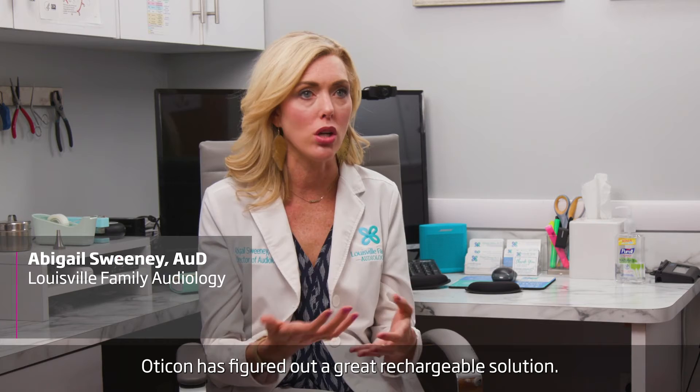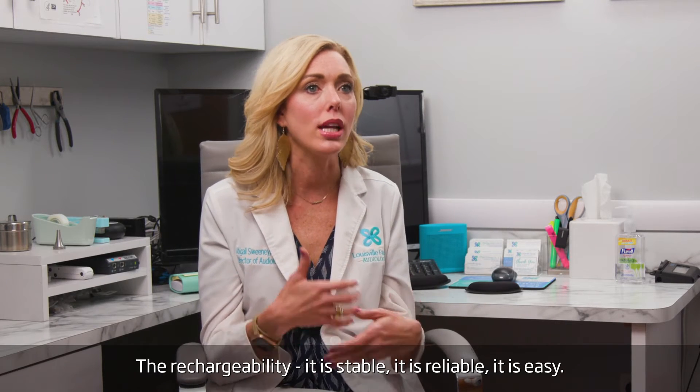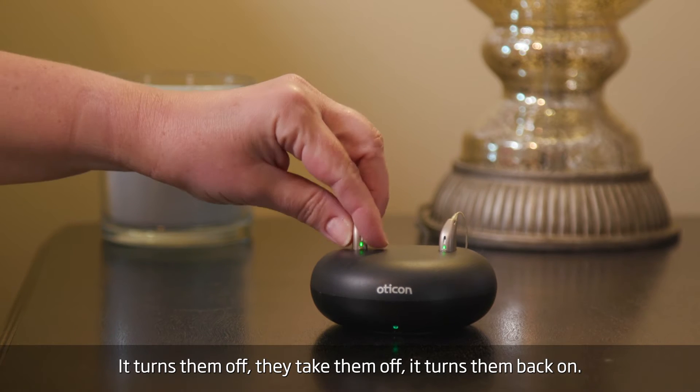Oticon has figured out a great rechargeable solution. The rechargeability is stable, reliable, and easy. Patients can stick them in their charger — it turns them off. They take them off, it turns them back on.